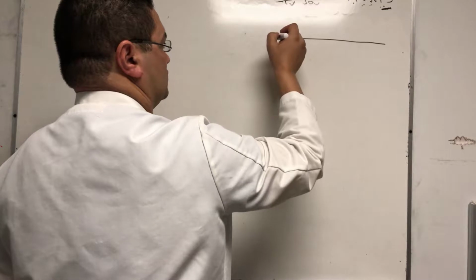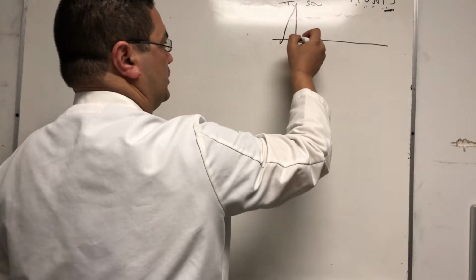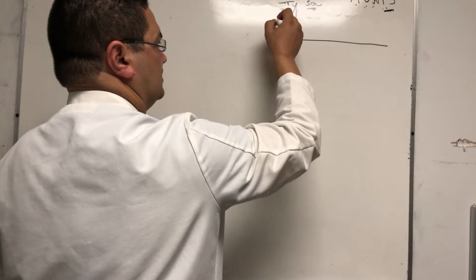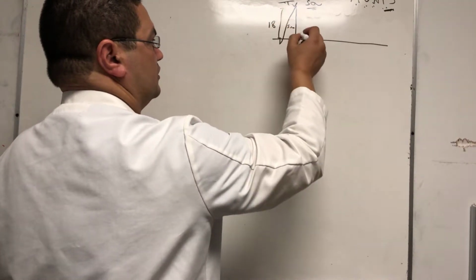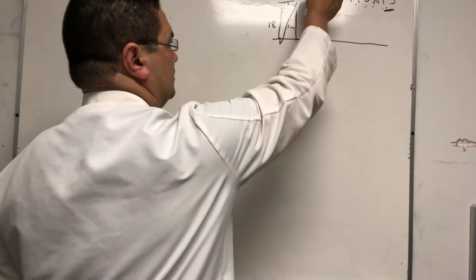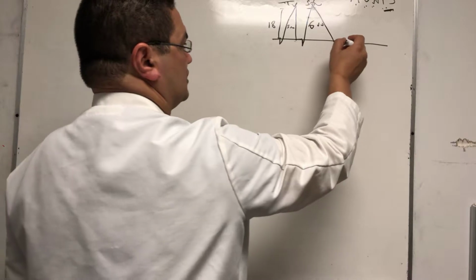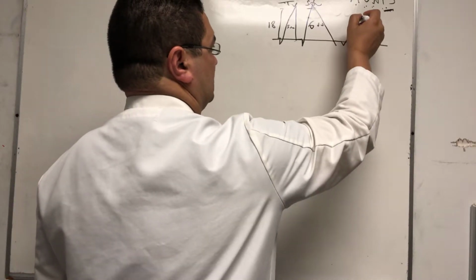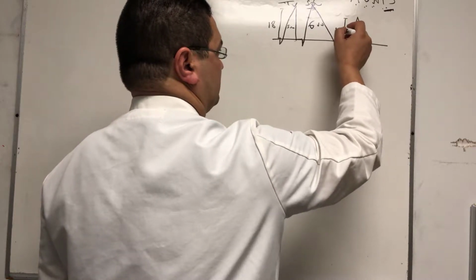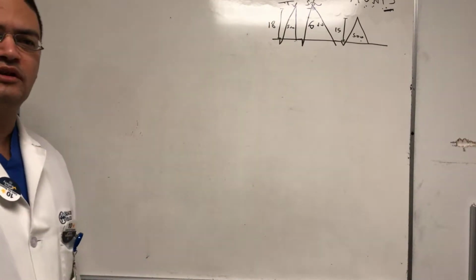You don't order pressures. So it goes like this, it gives whatever pressure it takes to achieve the 500 tidal volume. Okay, let's say 18. And then when you improve, the machine sees that you don't need 18, because when it gives 18, it gives you 600 tidal volume, for example. So the machine adjusts it and actually goes to 15. And still this area under the curve is 500, and it doesn't need as much pressure, 15 now. And it keeps doing that until you reach very low levels, and that's you weaned yourself basically.